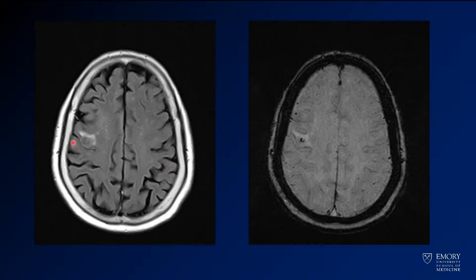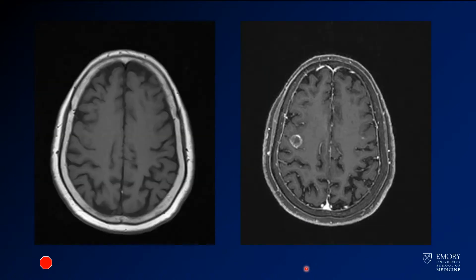What you see is some edema. You have a little area that's relatively T2 iso-intense to the adjacent gray matter. Here on susceptibility weighted imaging you've got a little bit of a rounded area of susceptibility. Here we have pre and post contrast — pre-contrast T1 on the left and post-contrast T1 on the right. Now you see a ring-enhancing lesion. You've got a lot of enhancement and it's not intrinsic T1 shortening. So that's something you've got to consider.